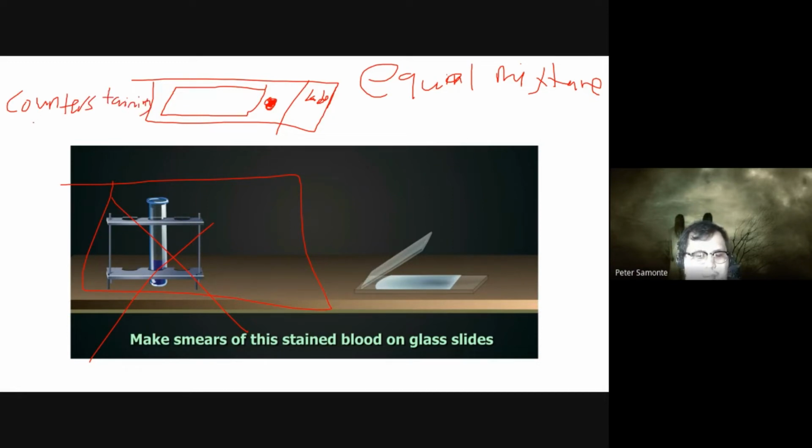Counter-staining. Let's talk about counter-staining. Your Wright stain, class, its purpose is to visualize other cells. Since you're talking about reticulocyte count only, and the doctor's request only says retic count, you no longer need to perform counter-staining with Wright's, because you will not be looking at the RBC, the WBC, or the other cells. So you no longer need to counter stain it with Wright's.